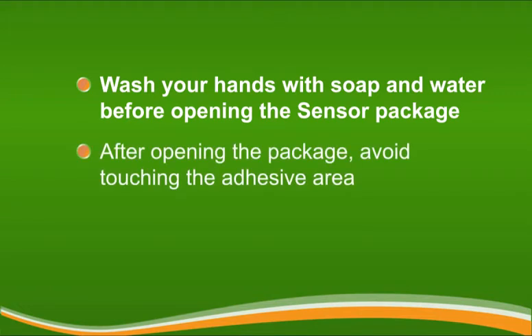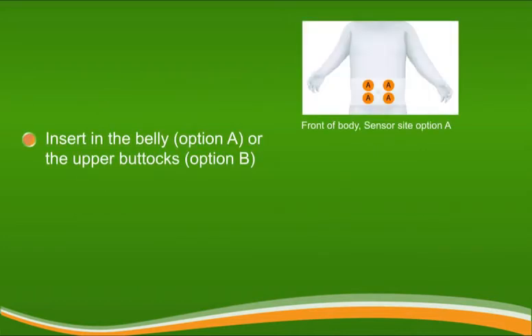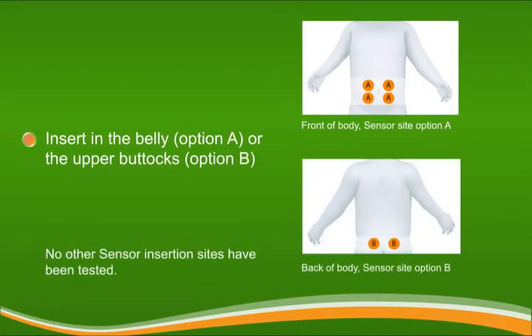After opening the package, avoid touching the adhesive area. Next, choose a site to place your sensor. Your site placement options are to insert in the belly, option A, or in the upper buttocks, option B. No other sensor insertion sites have been tested.